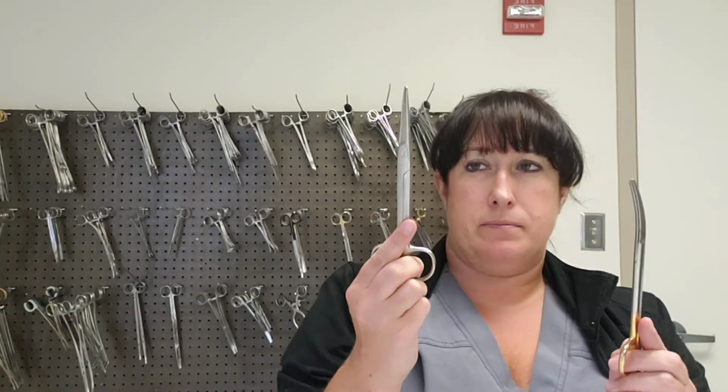Let's talk about the straight. So straight Mayos, you may more commonly hear these referred to as suture scissors. You need to know both names. And suture scissors are not intended for dissecting tissue. Suture scissors, straight Mayos, are intended to cut things that aren't tissue.